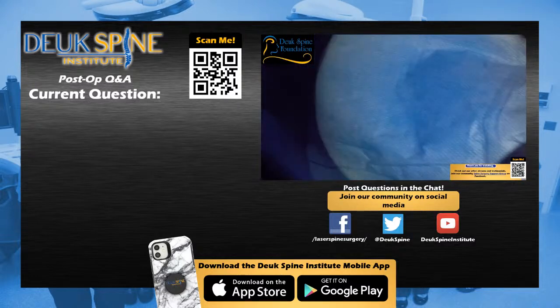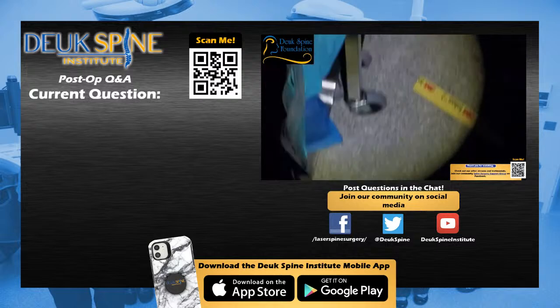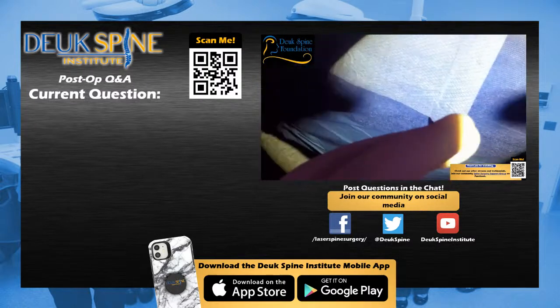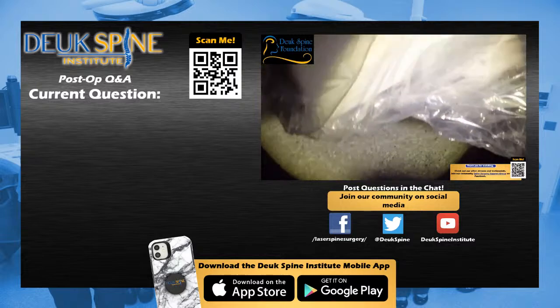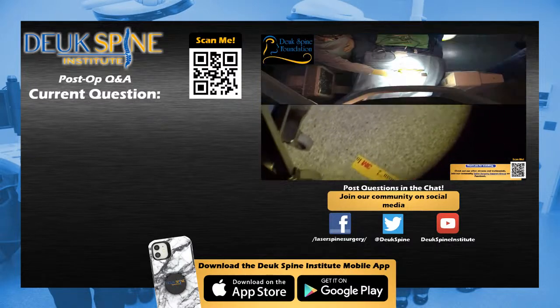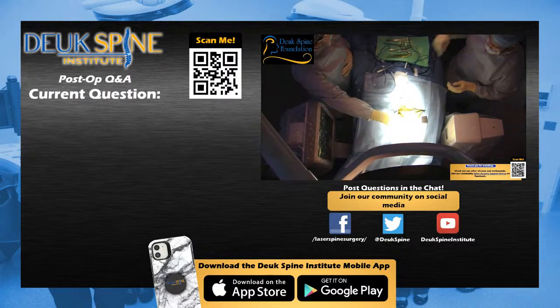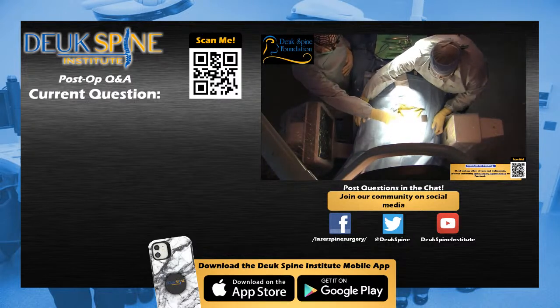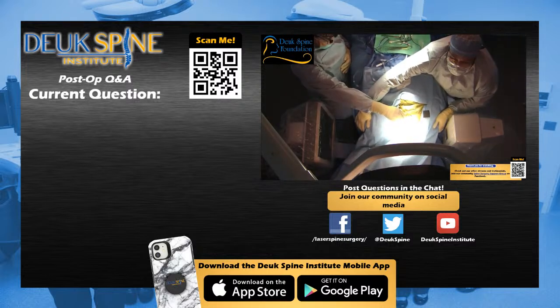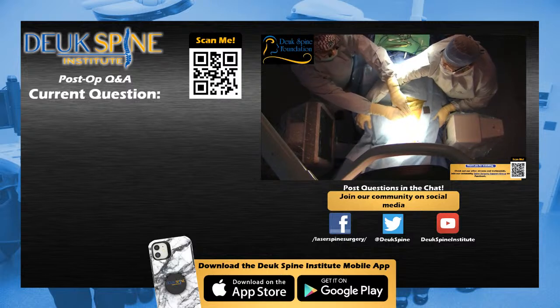Other than that, I was very happy. We had very little blood loss. The anesthesiologist did a phenomenal job of relaxing the patient. Let's talk about that for a minute. Muscle relaxation is very important in this case. In any type of spine surgery, I use very generous muscle relaxation right away in the beginning, and I hope that it wears off. We want really two twitches or more, maybe three twitches if possible, or even four at the end of the case. That means the patient's going to recover faster.